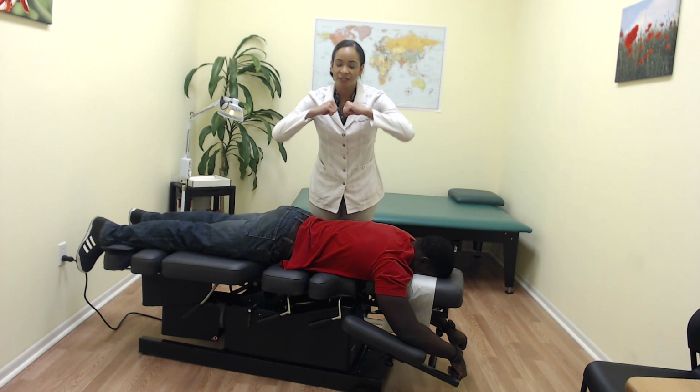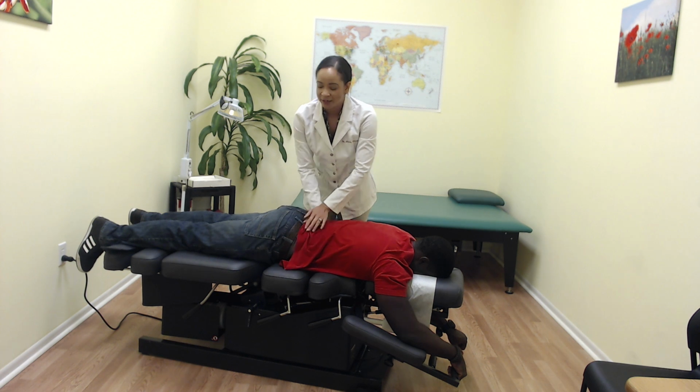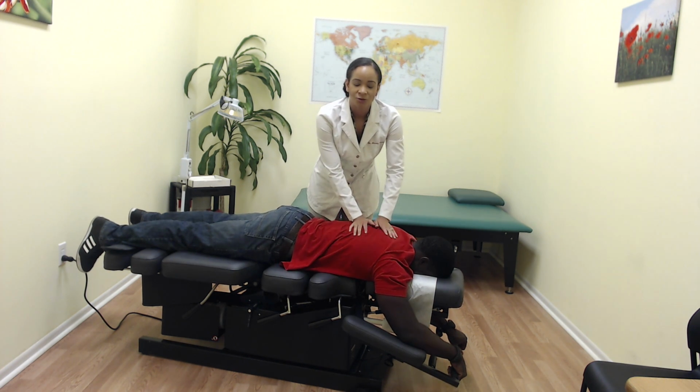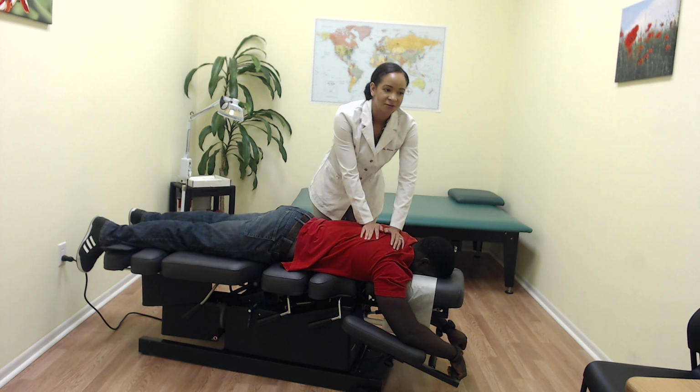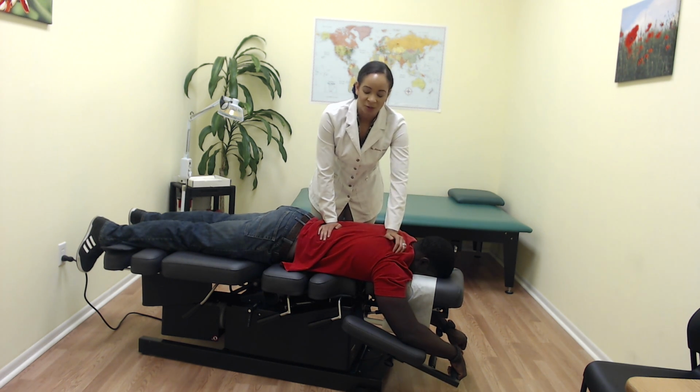It gets motion into those areas, and then it helps to increase the blood flow to those areas, helps to increase the amount of nutrition that's going to those joint spaces, and it really helps to facilitate the healing process, again, especially in patients who have disc problems.